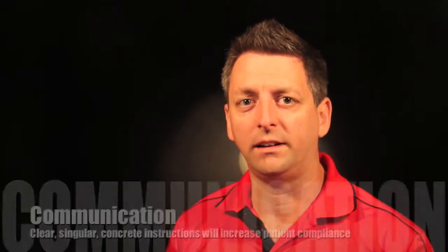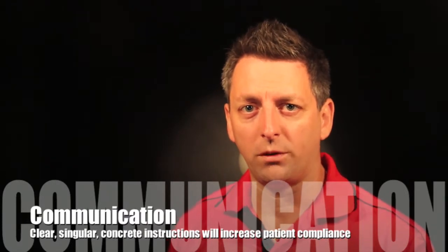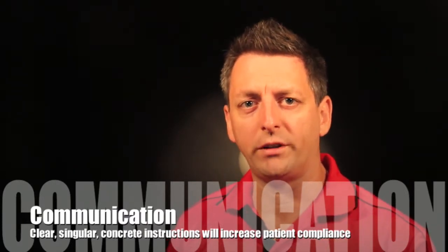But if you can focus them by speaking loudly and clearly to them, to their face, and you're the only contact with them, it does improve your compliance because they'll follow your instruction, and that's what you need to achieve. Them to follow what you need to say to them. So make sure you give them good and clear instructions and that they can follow that.